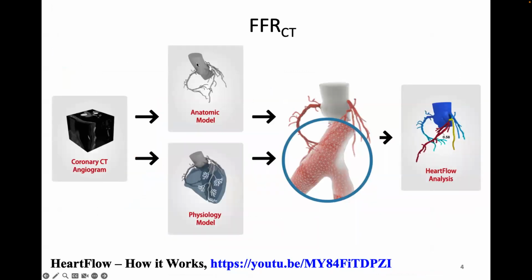Then we looked at this company HeartFlow that created a technique for calculating the fractional flow reserve with CT data by cutting out an anatomical model of the coronary arteries, looking at the anatomical model of the downstream muscle, and that's like the volume of blood required to go through these arteries, running a large computational fluid dynamic simulation to get the blood flow as a function in these arteries, and then measuring essentially the pressure drop as we go down an artery.